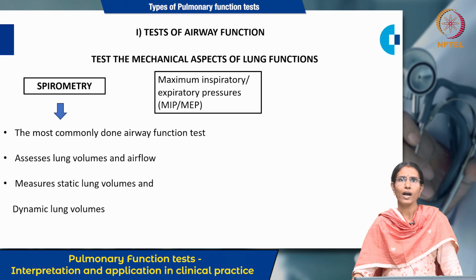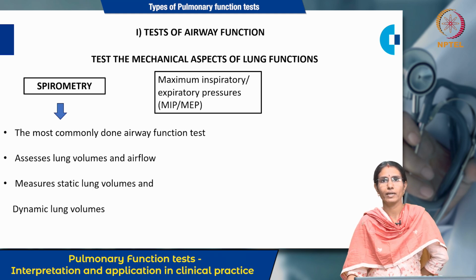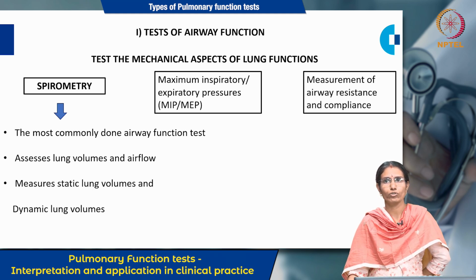And what are the other tests of airway function? Tests to assess the respiratory muscle strength, like maximal inspiratory pressure and maximal expiratory pressure, and also tests to assess the airway resistance and compliance. So, all these put together assess the mechanical aspects of the lung functions, and they are all tests of airway functions.